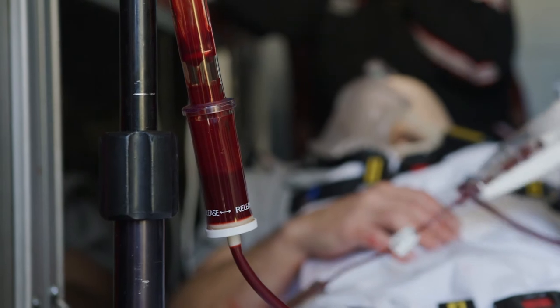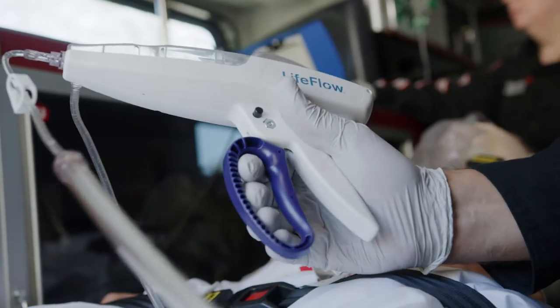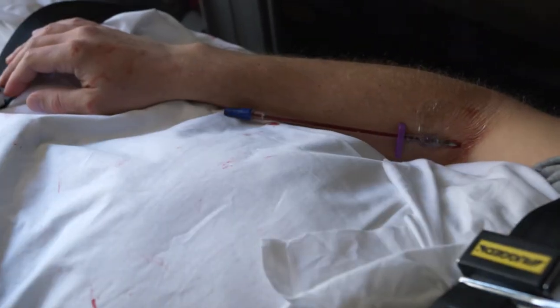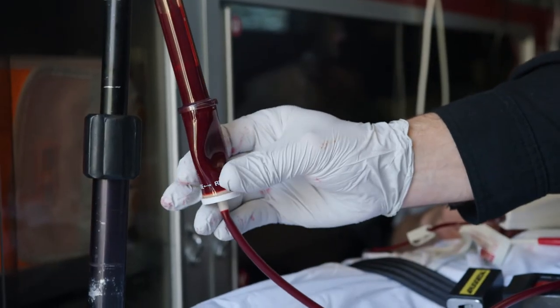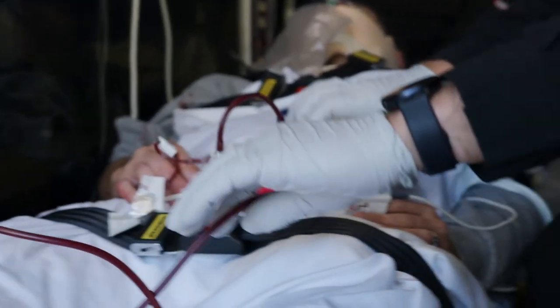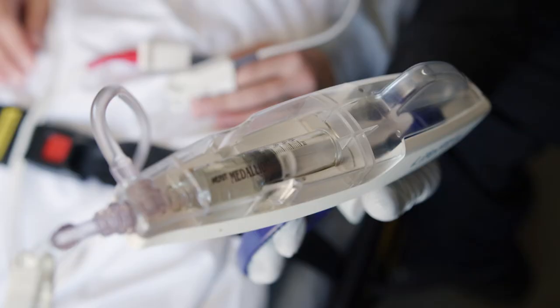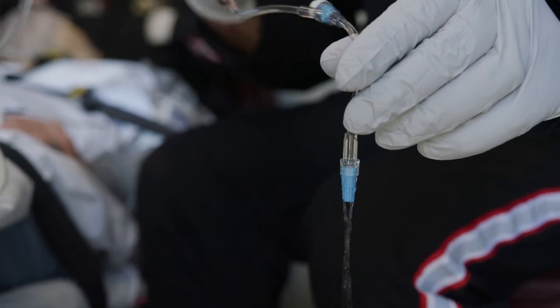If the ball reaches the bottom of the chamber, the air check will seal and the trigger loop will stop returning. This means you must stop infusing, disconnect from the patient, spike another bag, and reset the air check by first squeezing the middle of the chamber to refill it, then squeeze below the ball to release it. If air gets into the tubing below the air check chamber, you must reprime the entire tubing set before reconnecting to the patient.